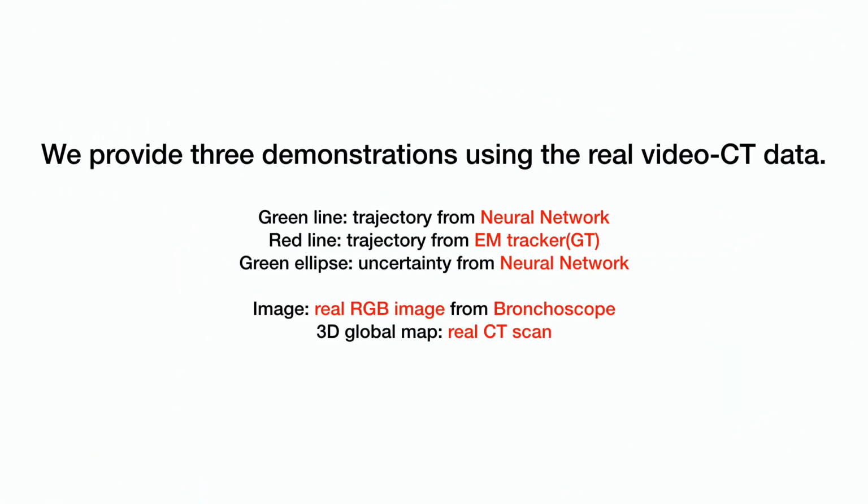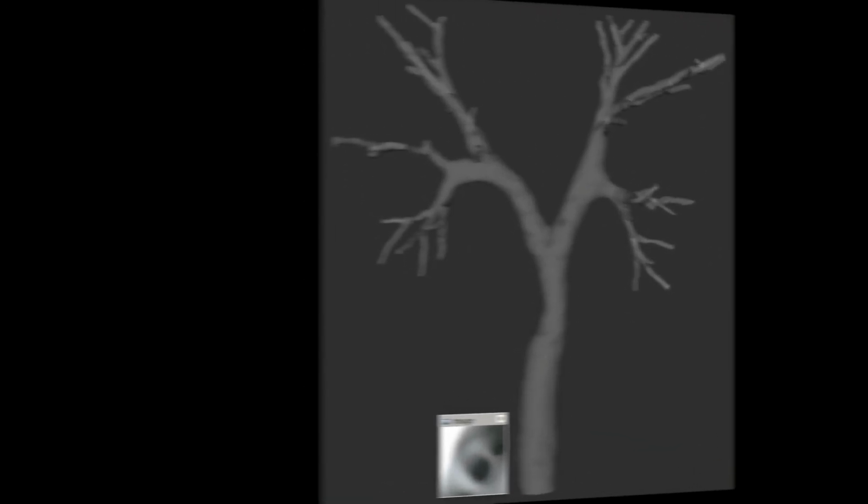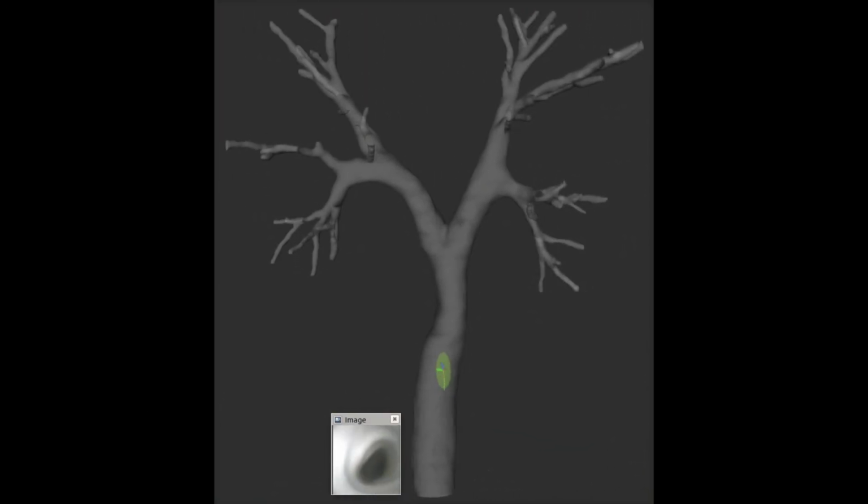We further provide three demonstrations using the real video CT data. The real image is captured from the bronchoscope and the 3D global map is generated from the real 3D CT scan. Green line, trajectory from neural network. Red line, trajectory from M-tracker. Green ellipse, uncertainty from neural network.